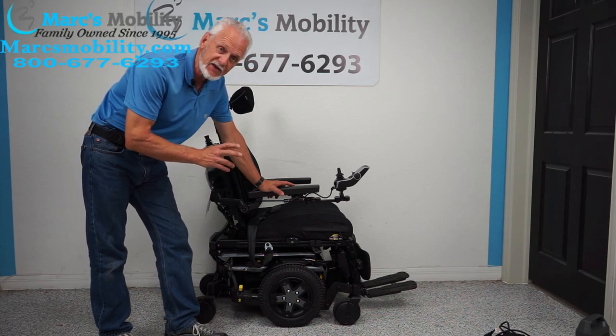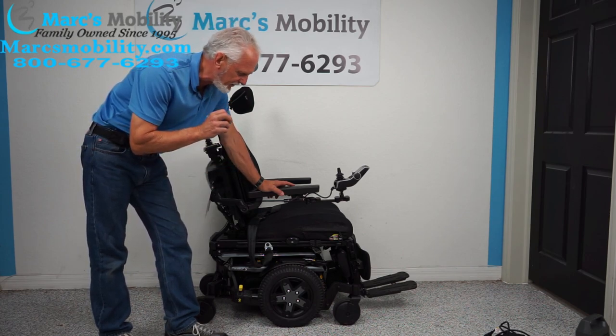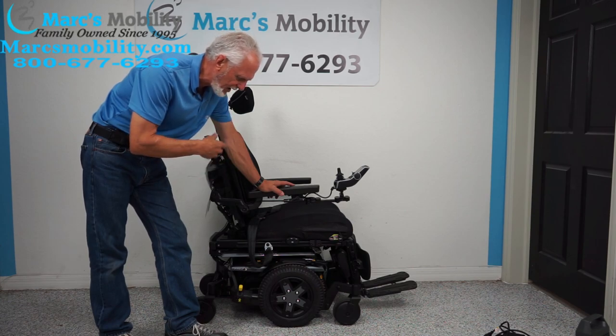We have here a beautiful Quantum Edge 3 in metallic silver. This power chair has 8 miles, so it was only used for less than a week — practically brand new.